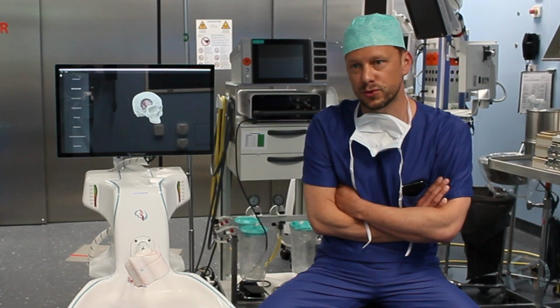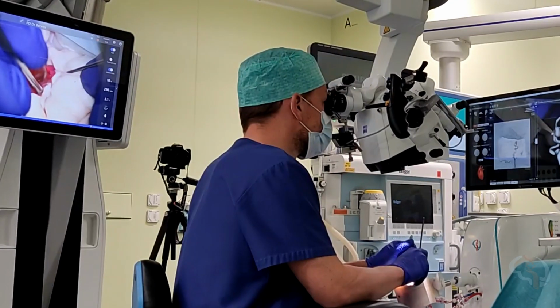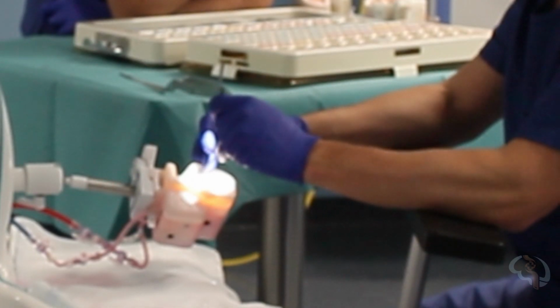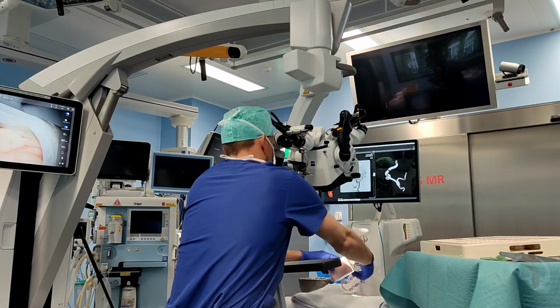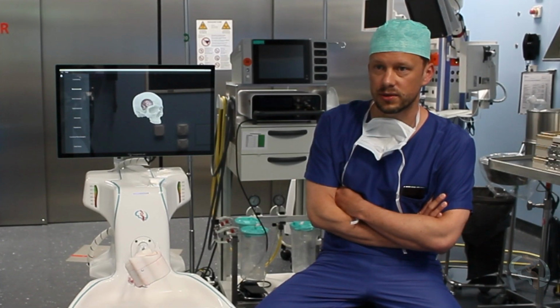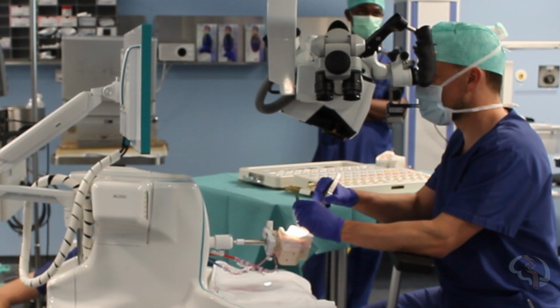What's really good is the perfusion. You can really see and feel the aneurysm pulsating and being perfused, and manipulate the aneurysm in the brain as you want without the risks involved in surgery. Orientate the head in the position that you're used to. What's really cool is that as soon as you install everything, you have the same sitting position, the same microscope, and the same position of the hands that you use during surgery. So everything is very close to the orientation that you would have during real-time surgery.